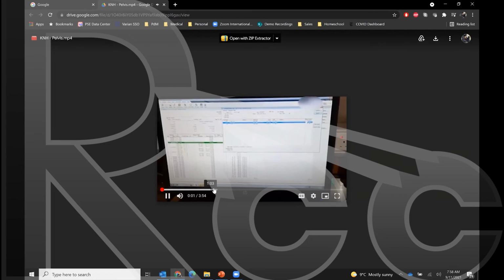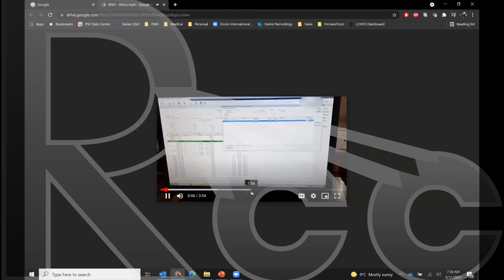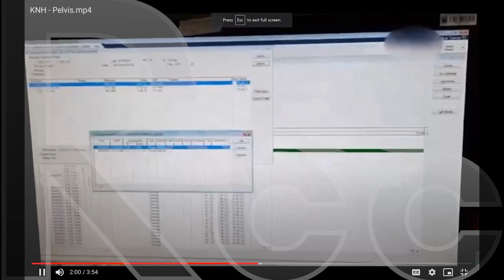All right. So I'm going to skip forward to where the good stuff happens at about 2 minutes here. One thing to note is this is an Elekta linear accelerator using Mosaic for image matching and imaging. What they're doing here is taking MV images, and this is one of the visualization techniques. We have the red being the treatment image and the black and white behind being the DRR from the treatment planning. It is kind of an interesting way to visualize. You can see that the color fades in and out based on what is well matched and what is maybe not as well matched.